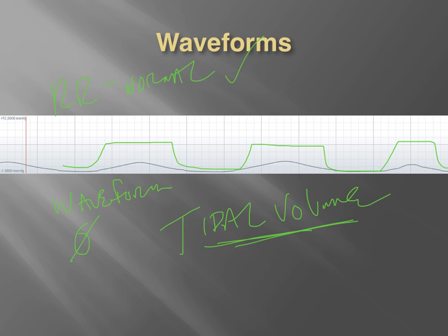And the reason their carbon dioxide levels are so low is because the carbon dioxide-rich alveoli are not fully being removed or exhausted from the chest, because the tidal volume is so poor. So all this patient really is exhaling is a little bit of mixing of carbon dioxide with that dead space air in the upper part of the airway and the trachea.